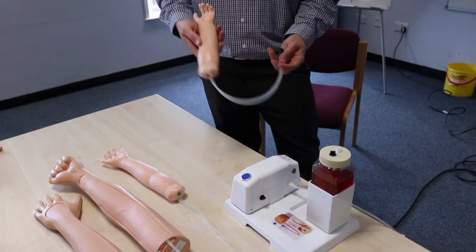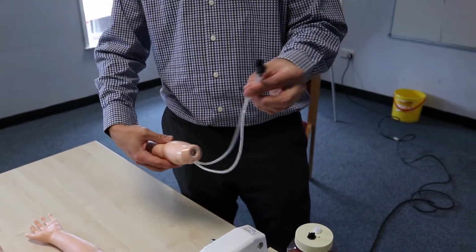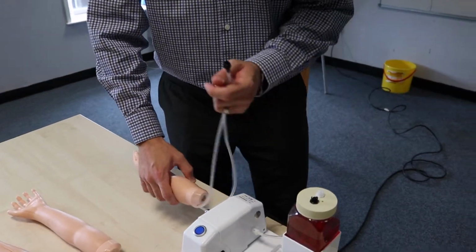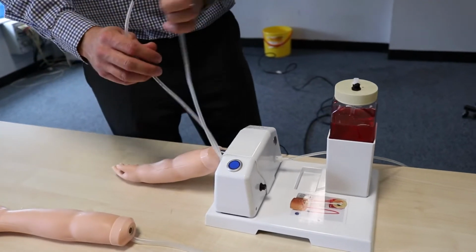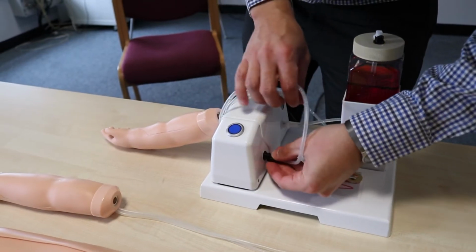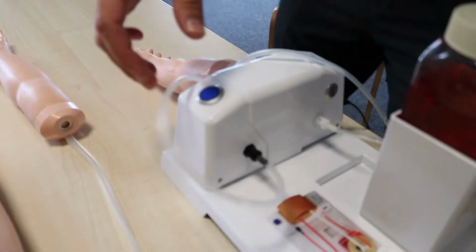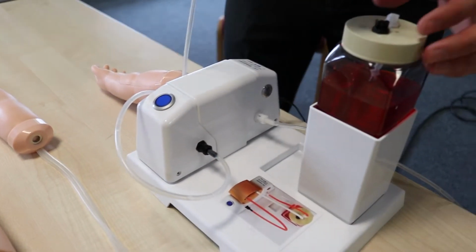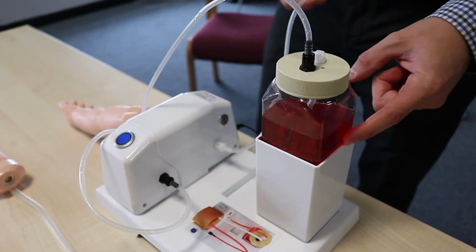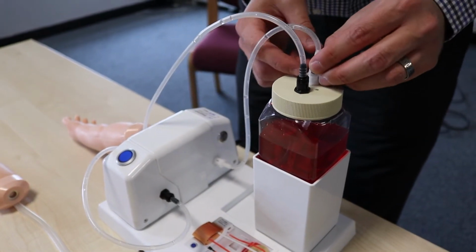So I'm going to use the infant arm, which is based on a one-year-old. So you've got a really simple vein system, which is one continuous tube and a magnet on the side. We just clip the magnet on, and then this black connector goes onto this black connector. Twist and click. This black connector goes on that one. And then we've got some blood concentrate, which is just distilled water and a couple of drops of solution mixed up.